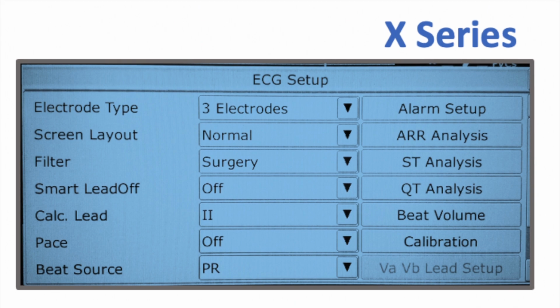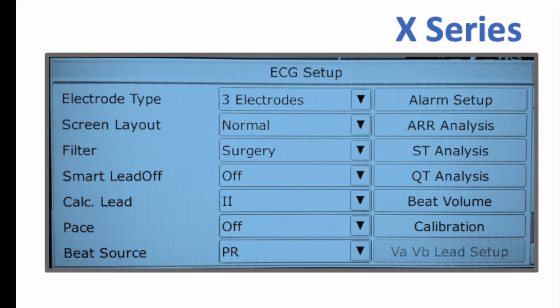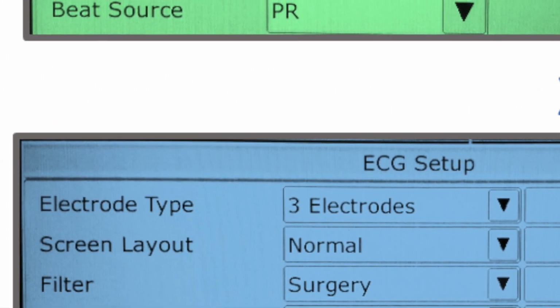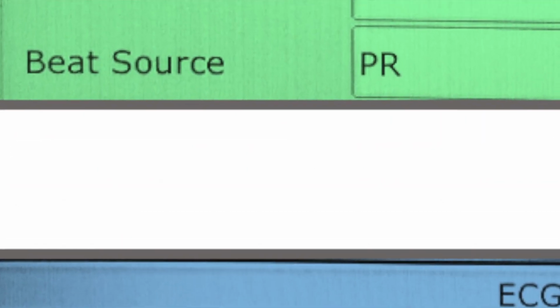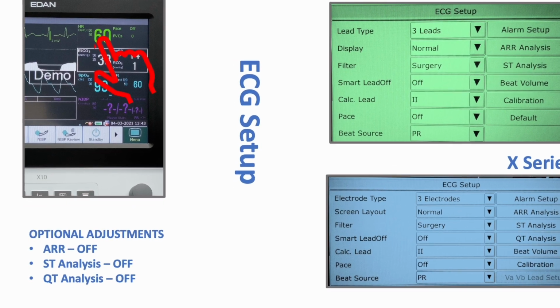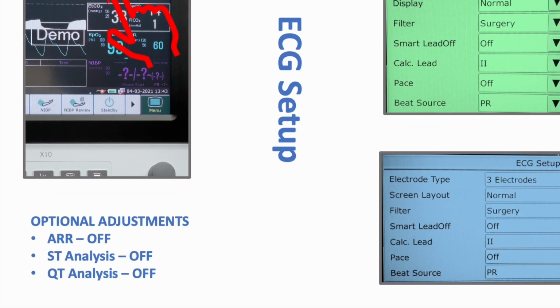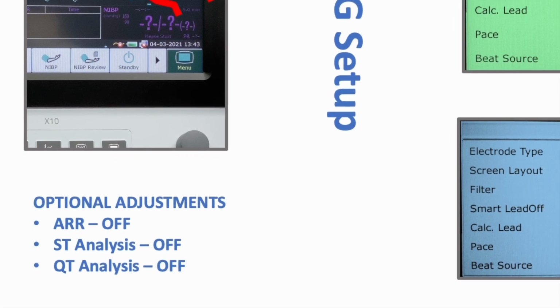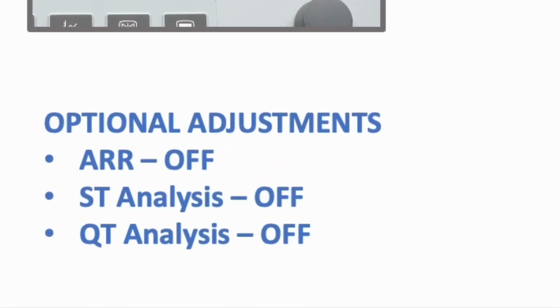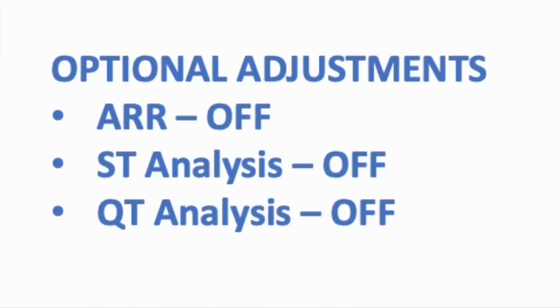It is very important that the beat source is set to PR. Setting the beat source to PR will allow the pulse oximeter tone change to be heard. Optional adjustments include setting the ARR, ST analysis, and QT analysis to off. These are advanced arrhythmia analysis options that are not often utilized with a 3-lead ECG cable.